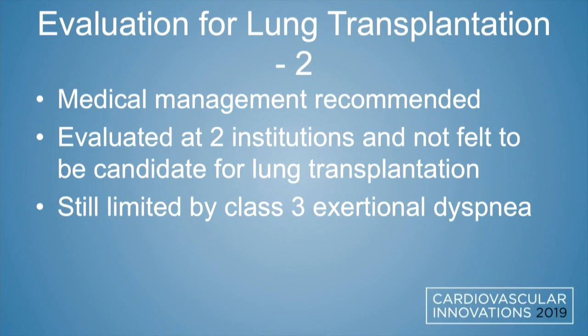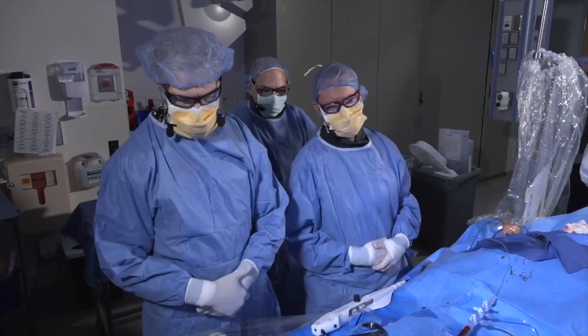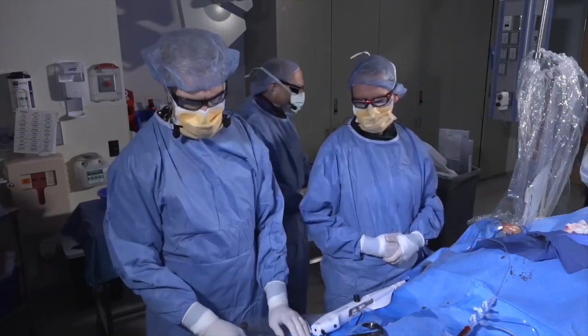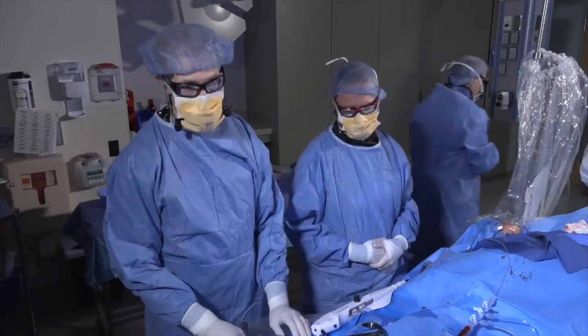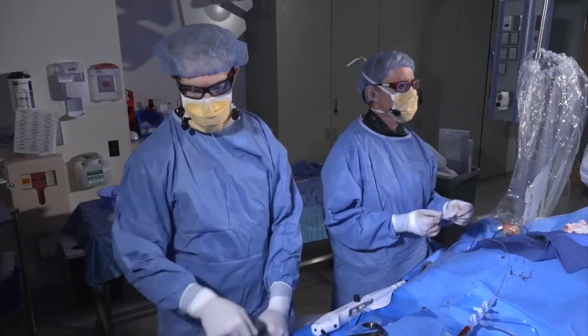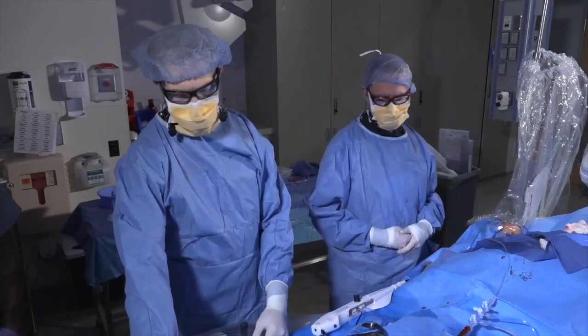Yeah, so to that point, I had the luxury to see this lady in clinic. Actually, she's one of my patients. And the remarkable thing was exactly what you just said. The pulmonary team felt that the symptoms were mostly lung-related, and that the coronary artery disease perhaps was not significant. And because of her lung disease, she wasn't really a candidate for a redo bypass, which I agree, but they completely disregarded the option of doing something percutaneously to both the left main LAD and the right, as Glenn is showing.